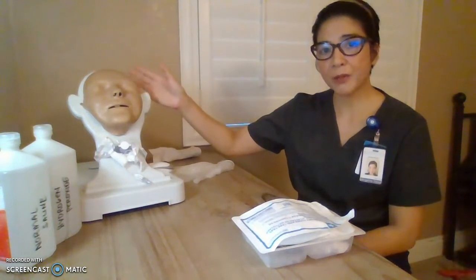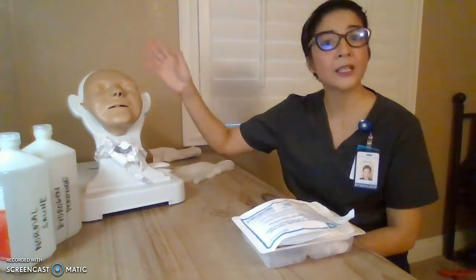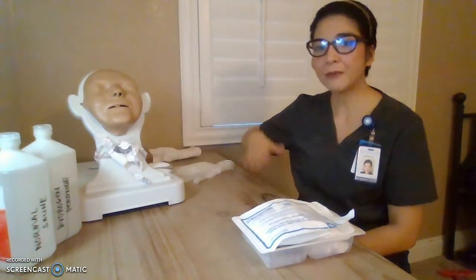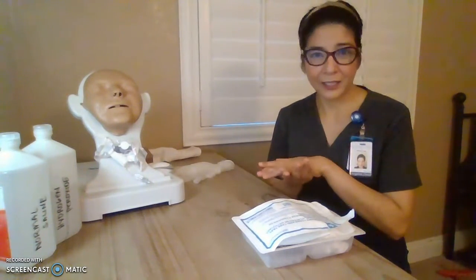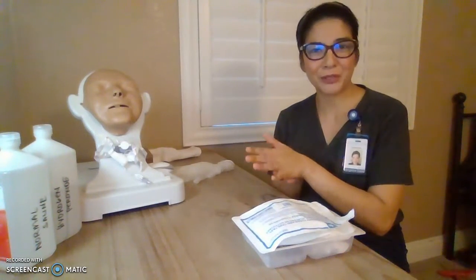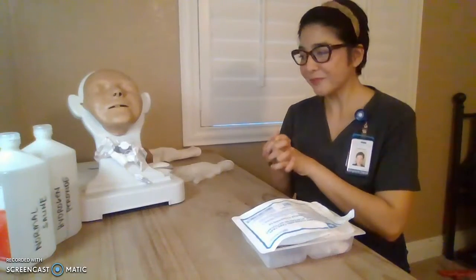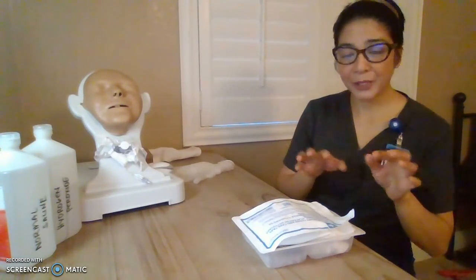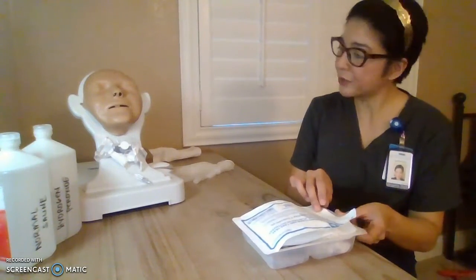So this procedure requires your patient to be in a semi-Fowler or Fowler position as tolerated, okay? And have a good working height as well. Usually you'll be standing up for this procedure. And technically, this procedure requires two people, but in the real world, everybody's busy, so I'll be showing you how to do it on your own. Okay, it is possible. All right, so at this time, we have our supplies. Let me just arrange, Mr. Smith, my supplies. Are you okay?